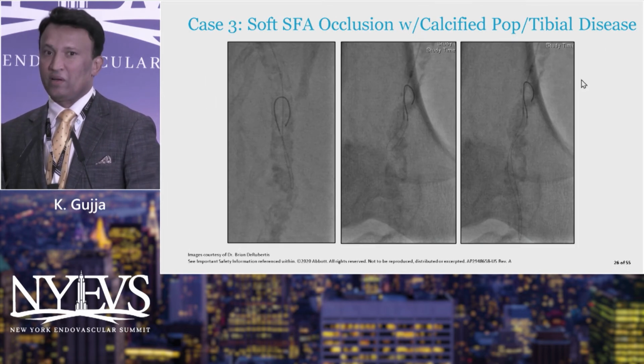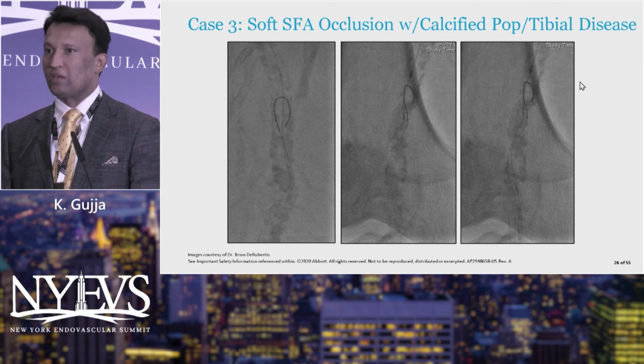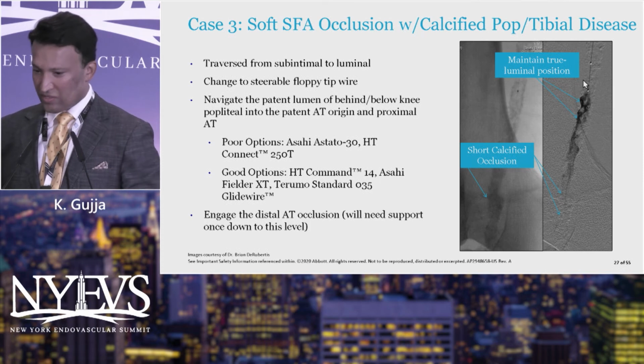If you're doing primary pedal intervention, it's again different. Then you have to play it through putting a sheath, putting 035 catheters, crossing again. Visualization again is an issue. So again, as I said, short occlusions.